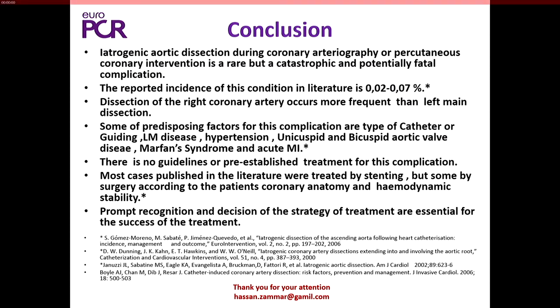Because it's so fragile in there, the wire could easily go in and out of the true and false lumen. Yes, you are right. Sometimes the change of guiding catheter matters: this dissection was caused by the Judkins diagnostic catheter, so we took an EBU in this case.